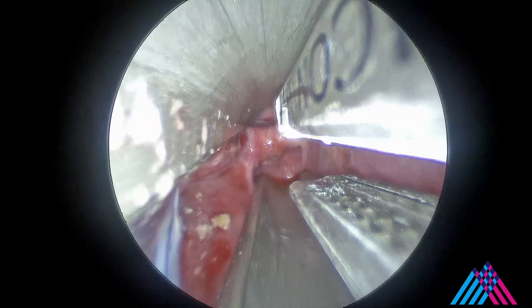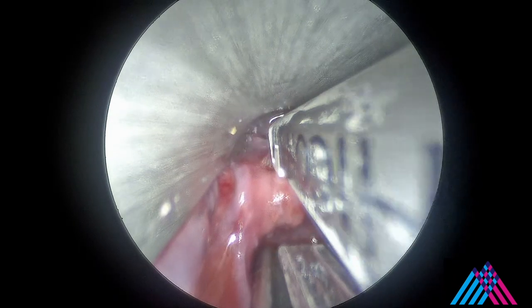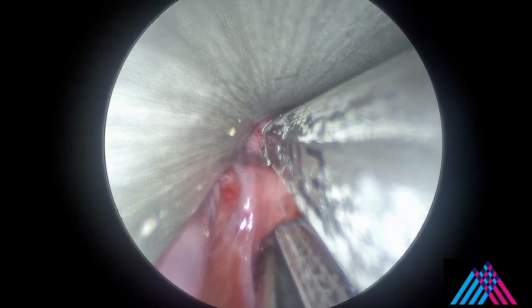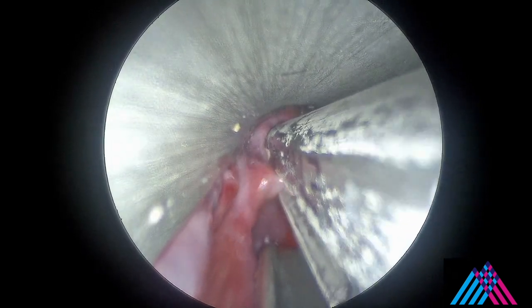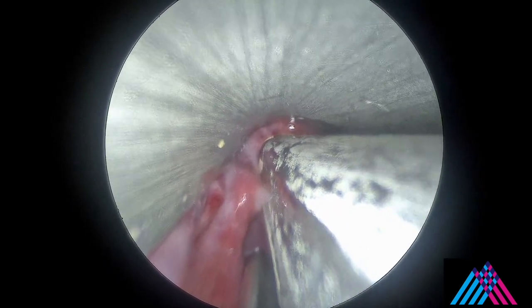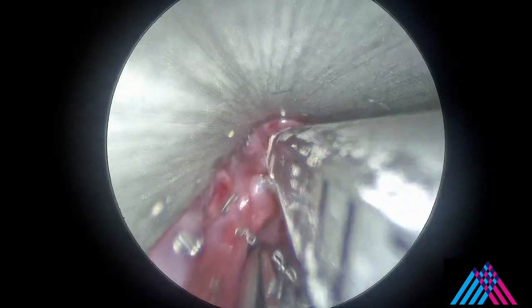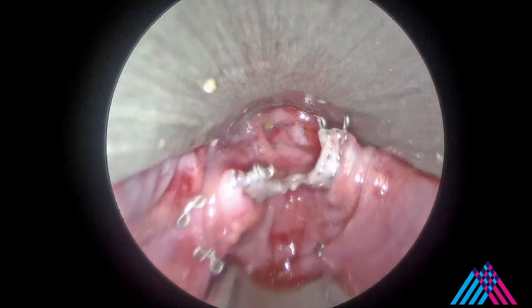An endo-GI stapler is slowly brought into the field. With one tine of the stapler on either side of the party wall, it is slowly deployed. There is a small inferior remnant to the party wall as expected.